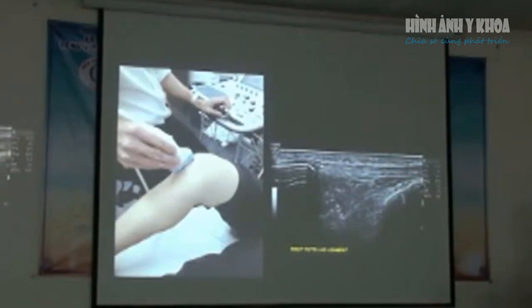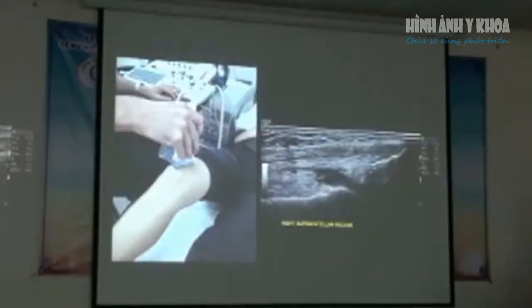In this position, the patellar tendon is under strain. So sometimes when you put the tendon under strain, you can obliterate small vessels. Ở đây thì có cái bệnh lý là giãn dây chằng bánh chè. Ở nơi này mình sẽ thấy có tăng sinh mạch máu. So I also scan the knee in a fully extended position as well. Mình cũng có thể khảo sát được cái sự duỗi gối tác động lên dây chằng bánh chè.